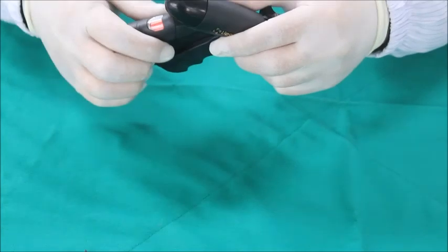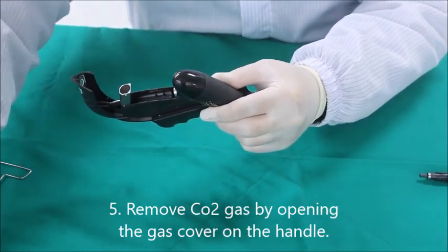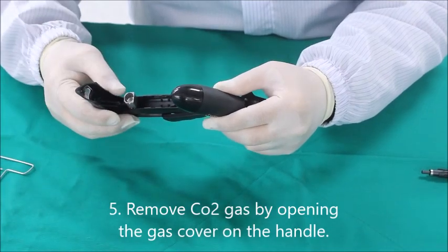remove the degas pin and open the gas cover on the handle to remove the gas cylinder. Shafts are disposable and should not be reused.